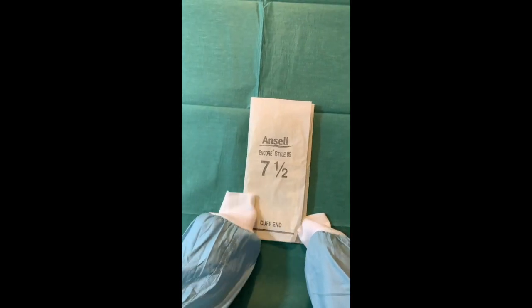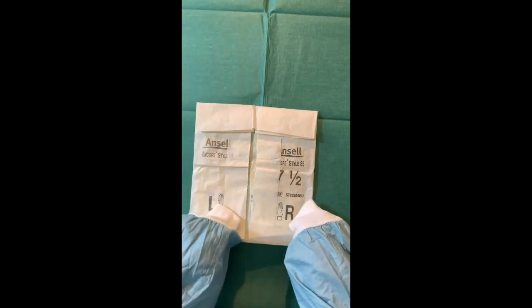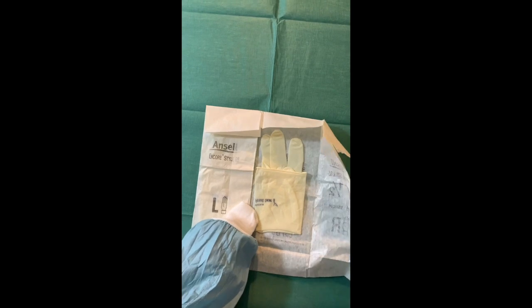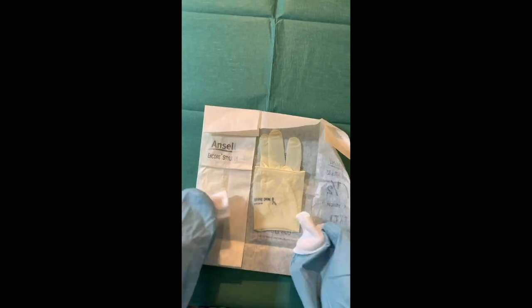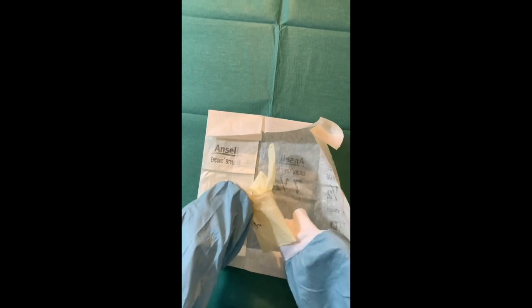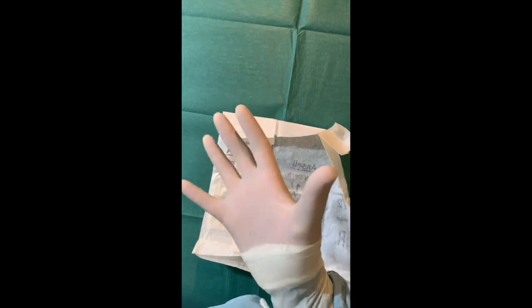We have the gloves — we can see that 'cuff end' is written here. What we would do is open these up. We've got left and right — hold these open, and then keeping our hands inside, we can remove this cuff and roll this down so our hands aren't leaving the sterile field.